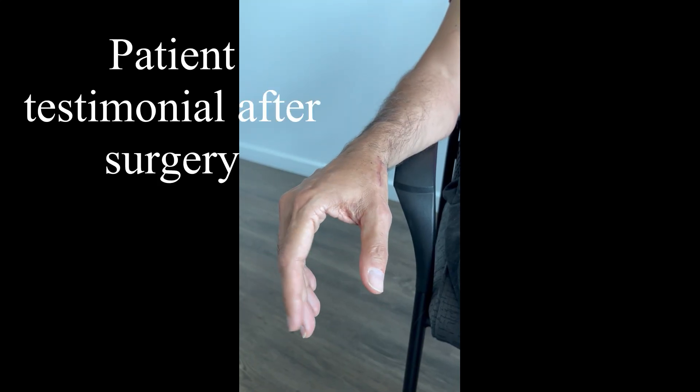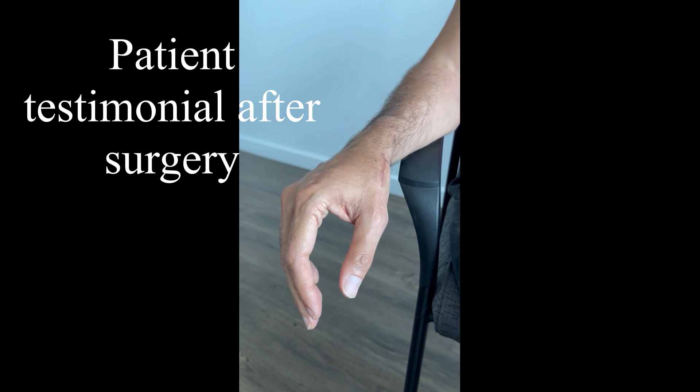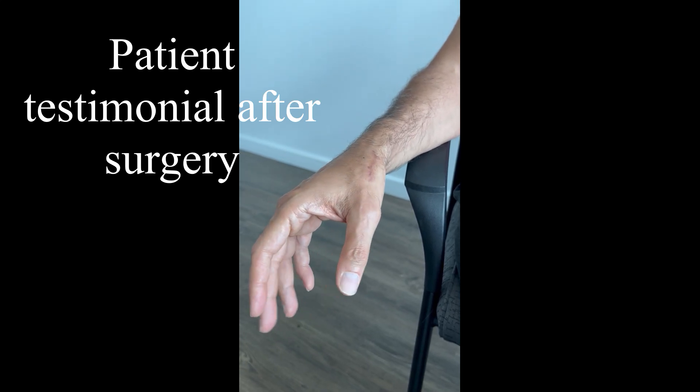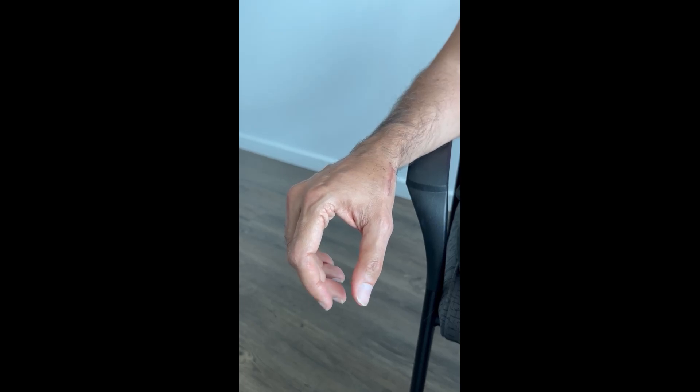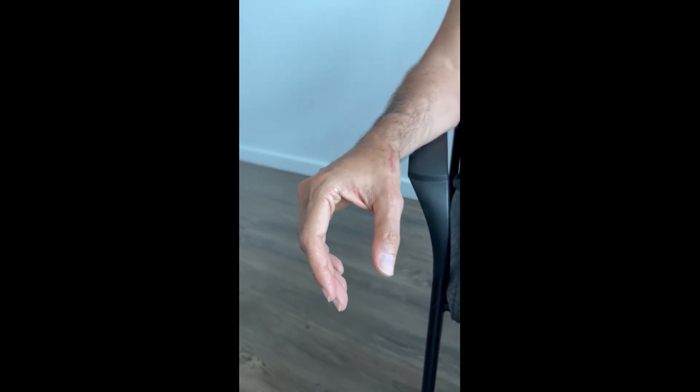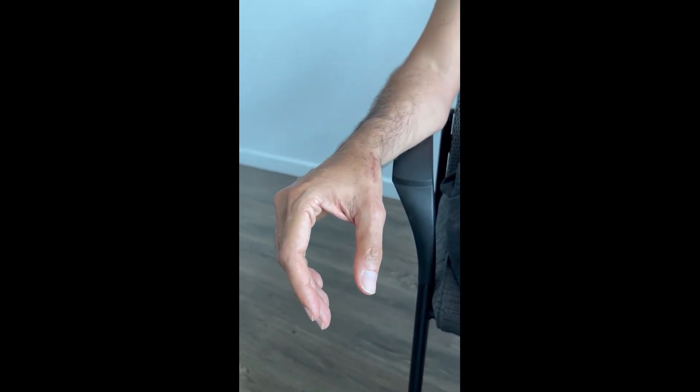Patrick, you had a joint replacement with an implant, the total implant, my implant, two months ago, done under WALANT. Can you share what your experience was? How did it go?